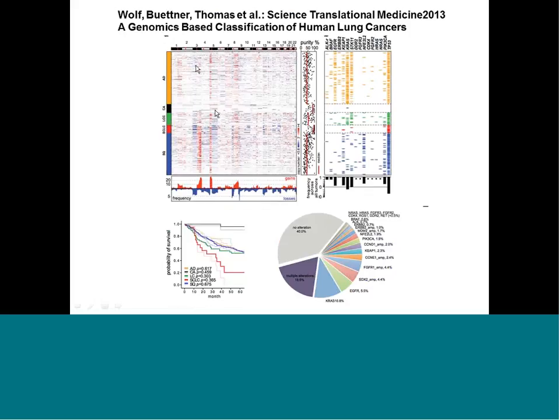And by only this one dimension of genomic information, you can immediately classify all adenocarcinomas, all squamous carcinoma, and the group of not otherwise specified unclear tumors are being nicely classified into neuroendocrine tumors, into large cell neuroendocrine and small cell cancers. And besides this, there are oncogenic driver lesions, which are specific for all these tumor entities.